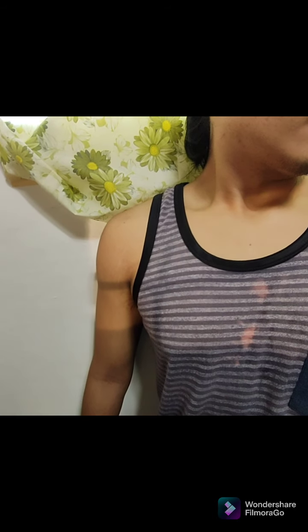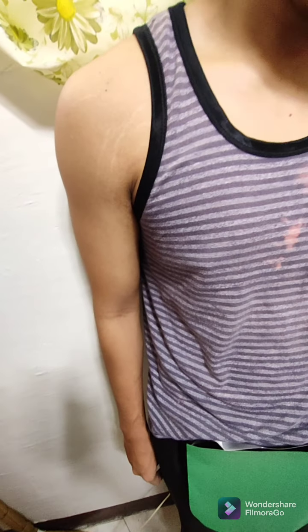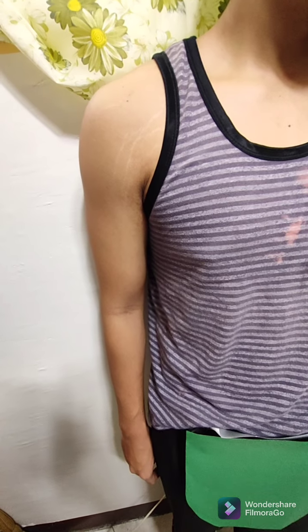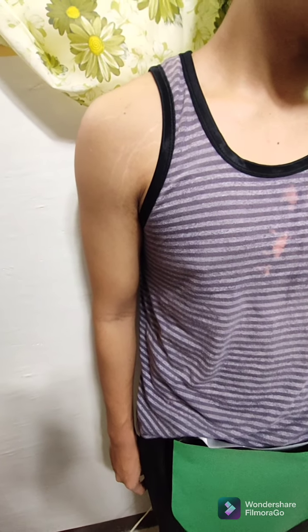So, sir, proceed na tayo sa pag-shoot ng beam. Inhale po, sir. Inhale. Then, you can now shoot the beam. So, okay na po, sir. Pwede ka na mag-exhale. So, the last position I will demonstrate is the Grashy method, or more commonly known as the posterior oblique position.